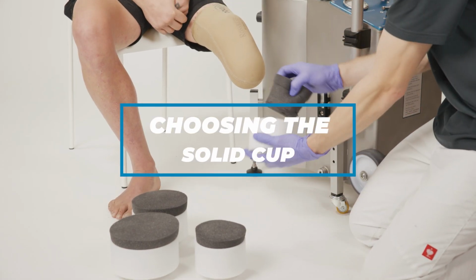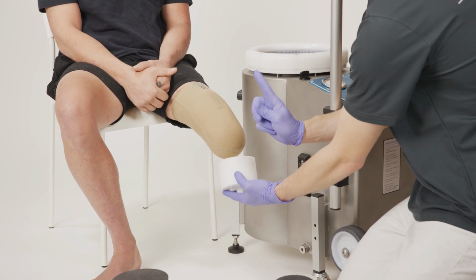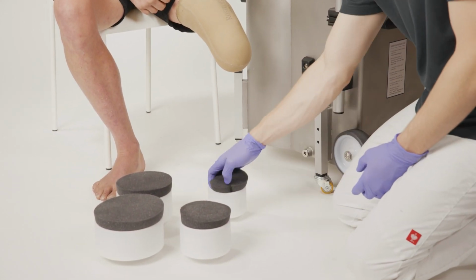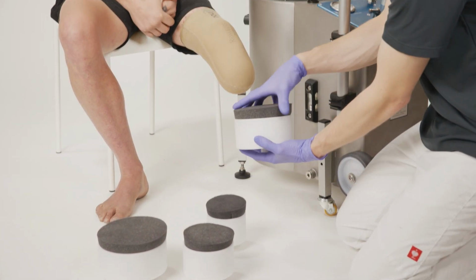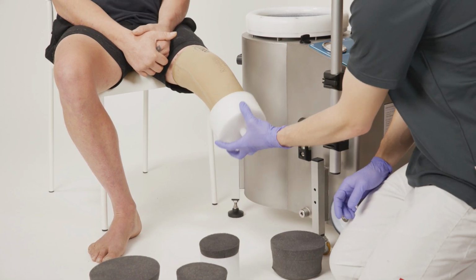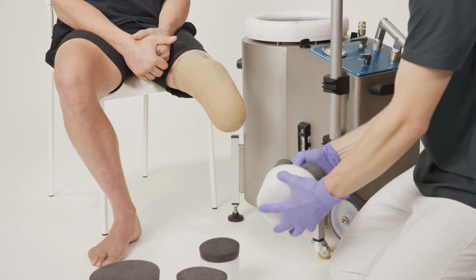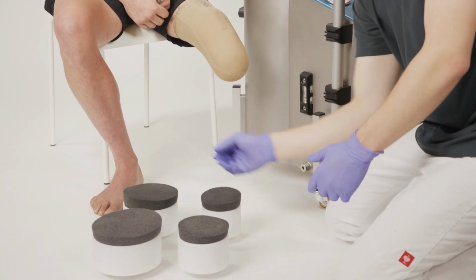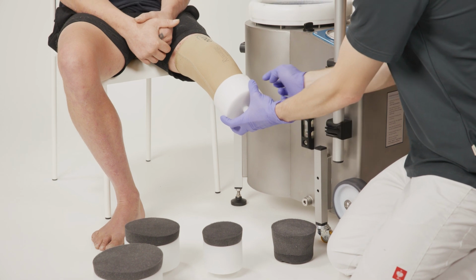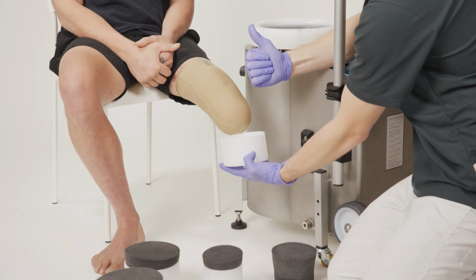Choose the solid cup according to the size of the distal end of the residual limb. The residual limb must not come in contact with the rim of the solid cup. If a solid cup that is too large is chosen, there is too much space between the residual limb and membrane. Choose the size of the distal end bearing cushion that fits the solid cup.